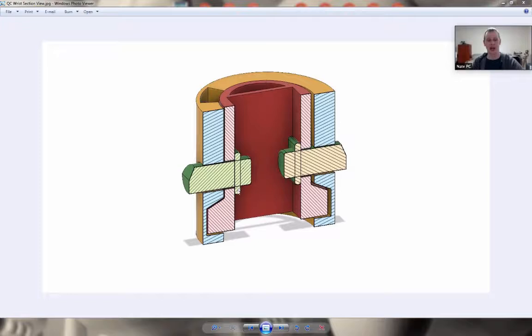There's going to be a compression spring that goes in between the two right here, and that will allow them to press in. We're probably going to have to clean out a little bit of this to allow the clearance to get them to go all the way in, but we can also pull the buttons in a little further too. Once that happens, you push these in, they'll always push back out because of the compression spring. To assemble the whole thing, you'll have this half. You'll lay these two buttons in there with the spring in, and then sandwich it with the other red half of the post.